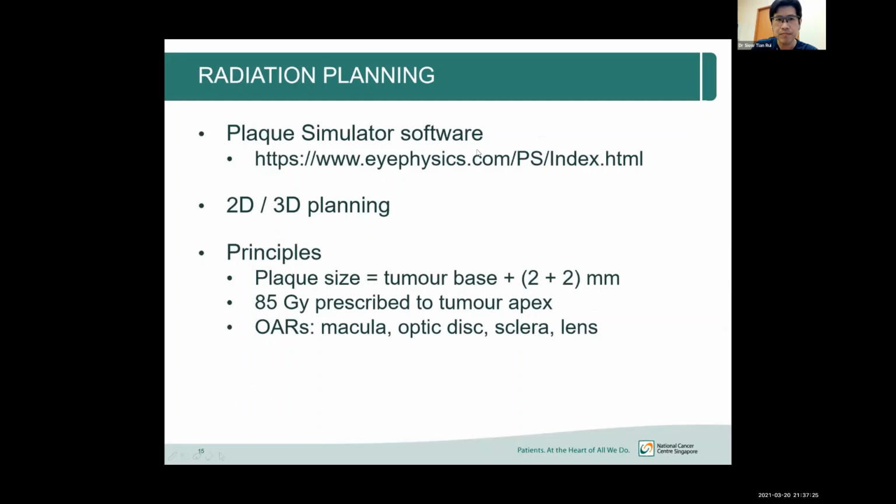Now we come to the nitty-gritty details of the radiation planning. There is one plaque simulator software out there that is used for this treatment. I think there's only one, and it's written by a physicist from the US. You have to find this online, download it and install it. There are some issues with it as well. I'll talk about it later.